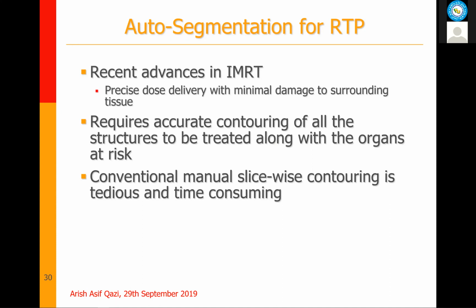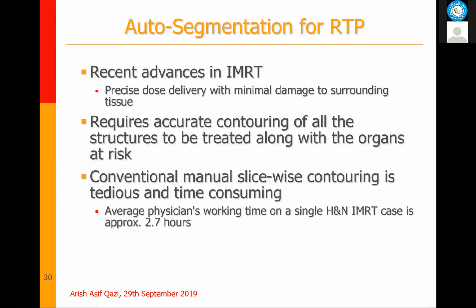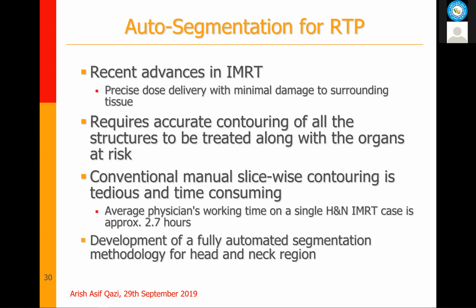Now, this takes a lot of time. As an example, an average physician's working time on a single head and neck IMRT case is about 3 hours. Imagine that if that whole method could be automated, then those 3 hours could be spent seeing new patients. And this is what the whole idea was: to develop a fully automated methodology for the head and neck region.